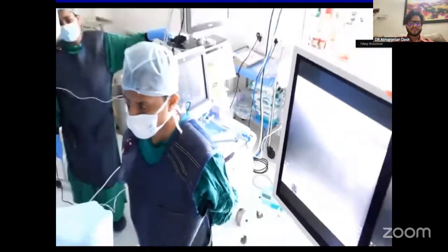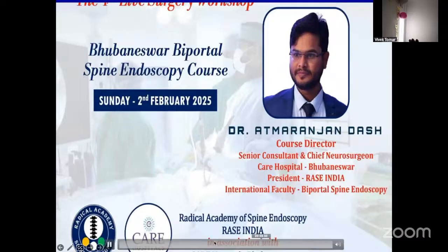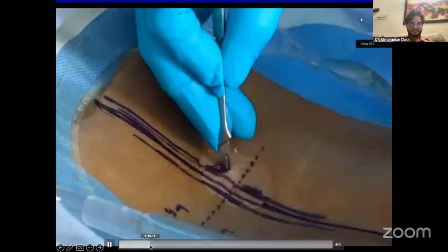So that you don't have a sword fight while operating on the system. So this is triangulation. The triangulation involves touching both the ports, so that you can have a common point of interest at the center. So once we are done with this, we move to the incision.